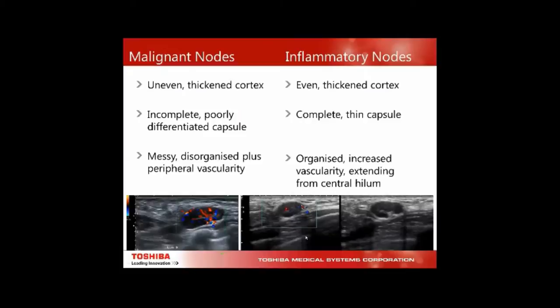Differentiating malignant nodes from inflammatory: you can't always. Malignant nodes mostly have uneven thickened cortices, an incomplete poorly differentiated capsule that gets fuzzy around the edges, and messy disorganized branching vascularity extending to the periphery. Inflammatory nodes will have an evenly thickened cortex, a complete thin capsule, and organized increased vascularity extending from the hilum — not extending out to the periphery.